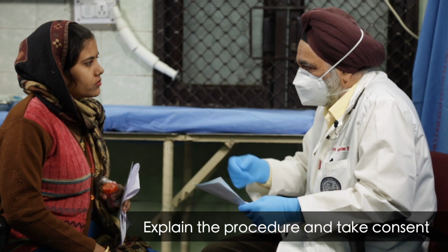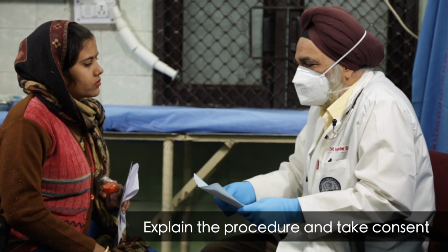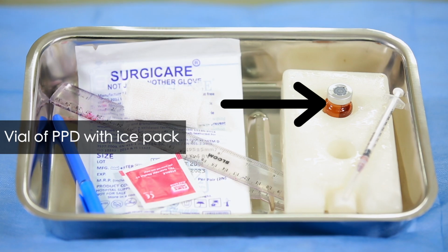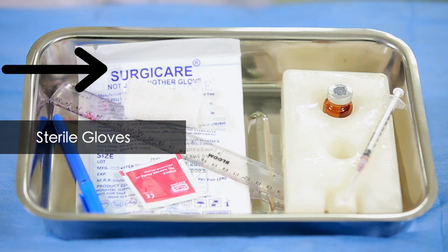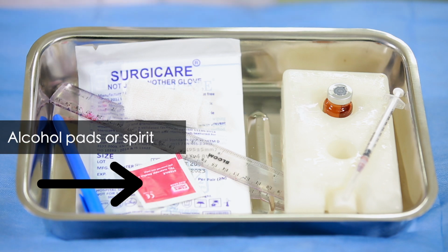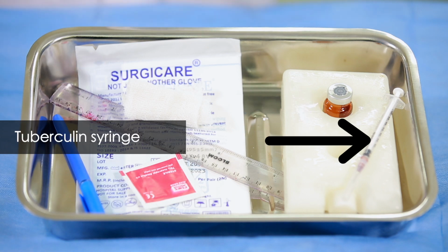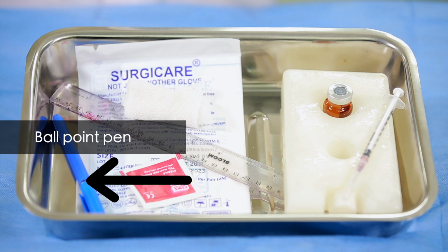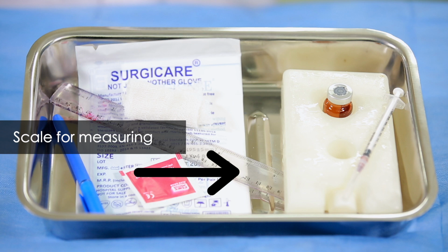Explain the procedure and take consent from the parent or guardian. Instruments needed for the procedure are a vial of purified protein derivative, that is PPD, with ice pack. This is to maintain temperature between 2 to 8 degrees. Sterile gloves, alcohol pads or spirit, tuberculin syringe, 27 gauge needles, sterile gauze, ballpoint pen, and scale for measuring. The Mantoux test is a recommended TST.